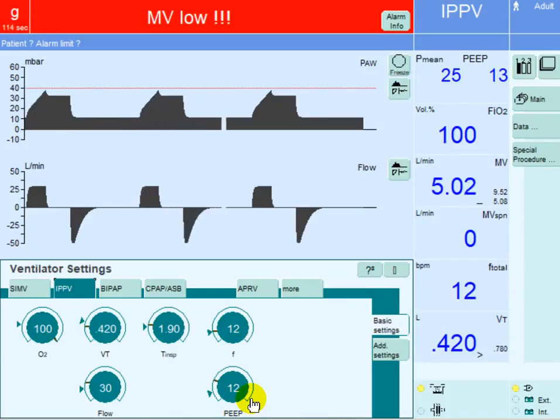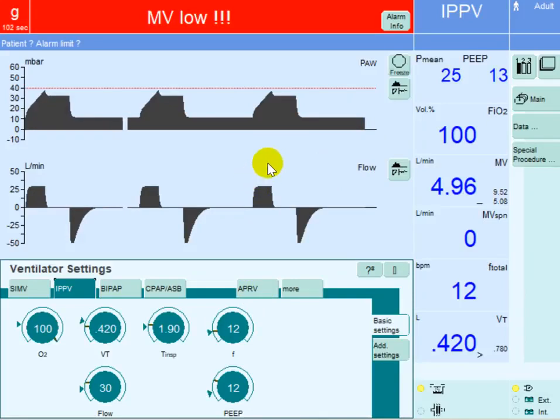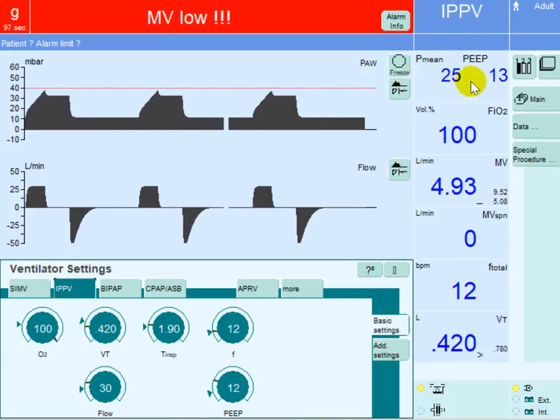In order to make the switch between volume-controlled mode of ventilation and APRV, you need to note what is the mean airway pressure provided with this mode of ventilation. You can see here it is 25 centimeters of water as the mean airway pressure.